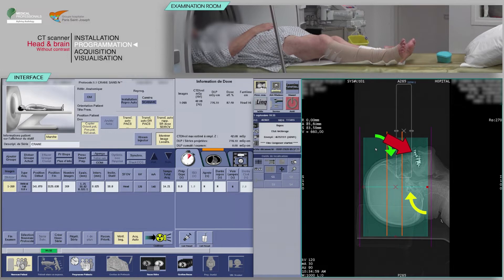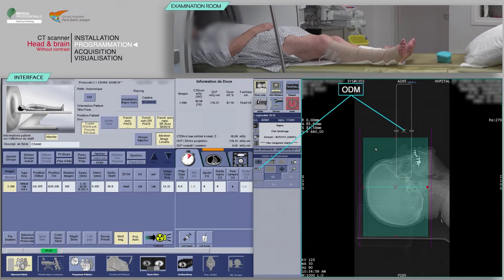If so, verify the patient's head is not tilted back too much in order to avoid the projection of dental artifacts in the posterior fossa. In order to optimize the dose delivered to the lens of the eyes, it is possible to place the ODM Organ Dose Modulation box in front of the skull at the level of the orbits.